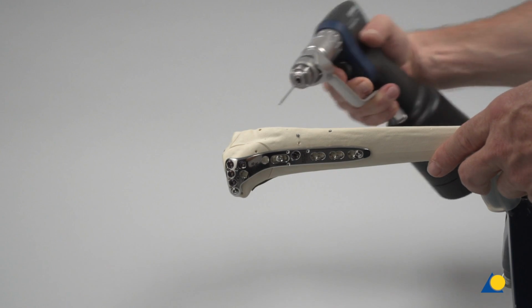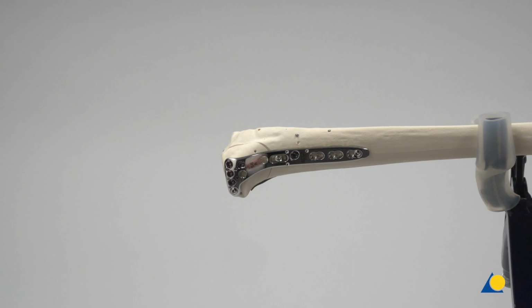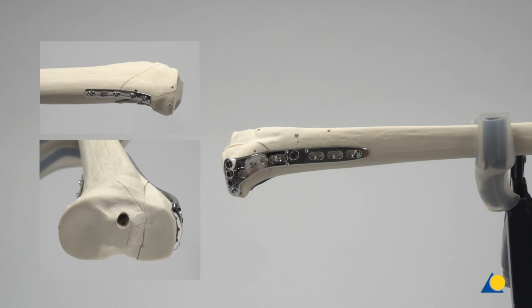Note that the cortex screw and/or VA locking screw insertion sequence and placement are dependent on the degree to which the plate matches the anatomy of the bone. In the case of very osteoporotic bone, the first cortex screw in the proximal plate end can be replaced with a locking screw, and the screw angle can be varied to optimize screw purchase in the bone or the subchondral support of the repositioned fragment. Additional locking screws can also be inserted in the shaft segment of the plate if necessary.